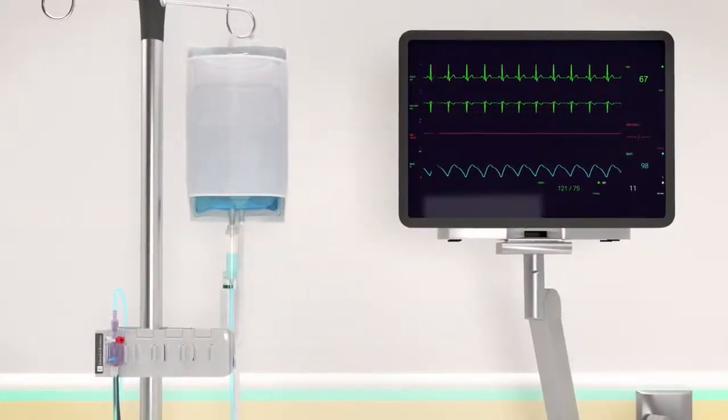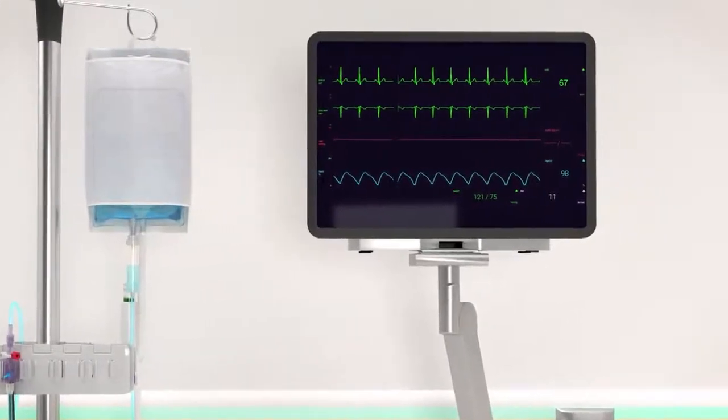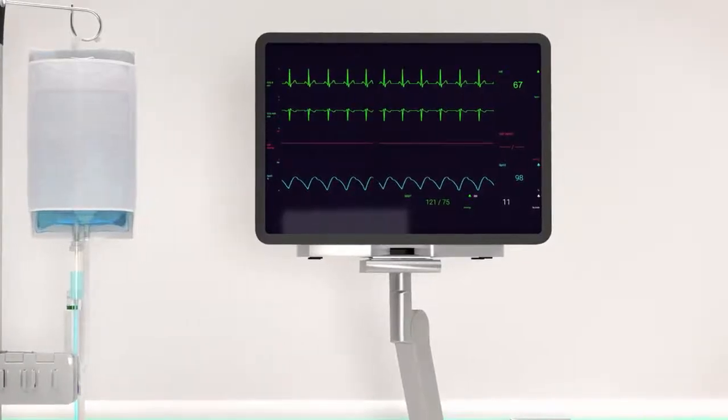Now that we have completed priming the system, we will need to calibrate the TruWave Transducer with the bedside physiologic monitor using the following eight steps.